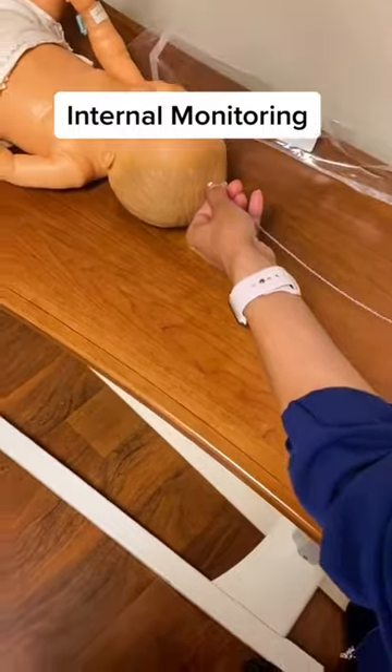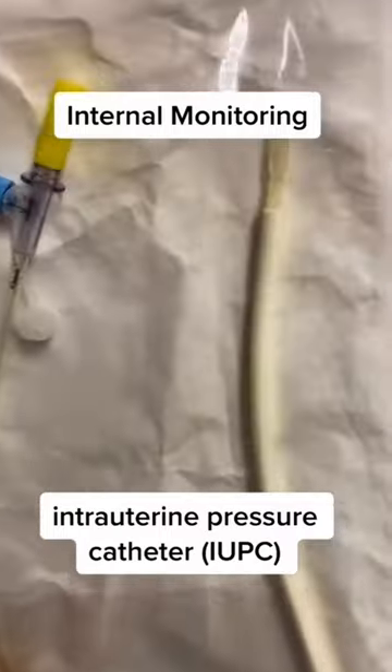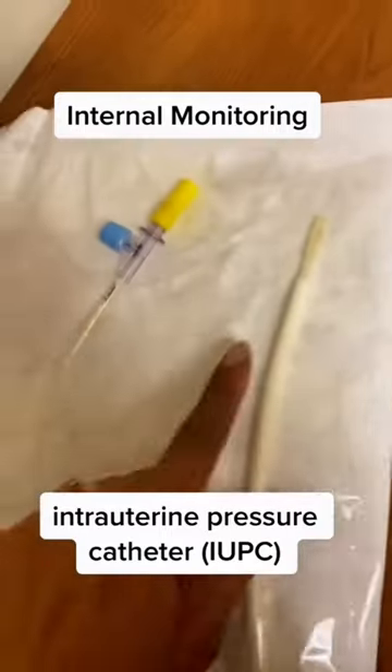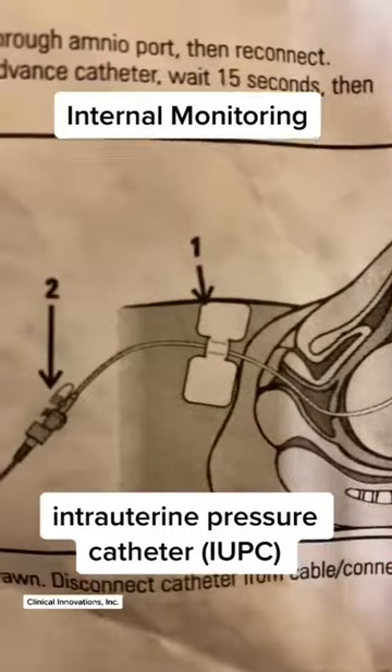Sterile gloves are used — I'm just using this for visual purpose. This is another internal device that monitors contractions. It's inserted into the uterus between the baby and the uterine wall, and it provides exact measurements of contractions. Here is a good visual.